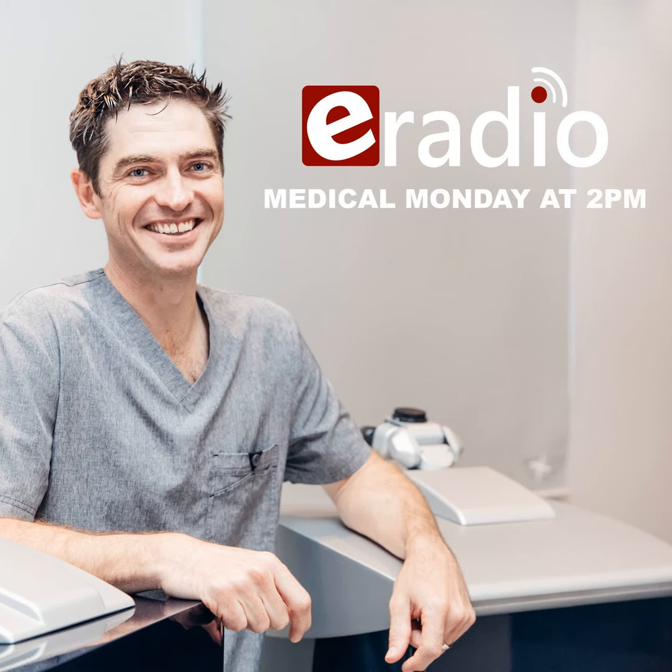If you think of the cornea, remember that we talked about it as being almost like a soccer ball shape. If you were to just laser a portion of a soccer ball, you'd flatten it and it would look like there's a bump. So what these new lasers do is they incorporate into the laser profile what we refer to as a transition zone.